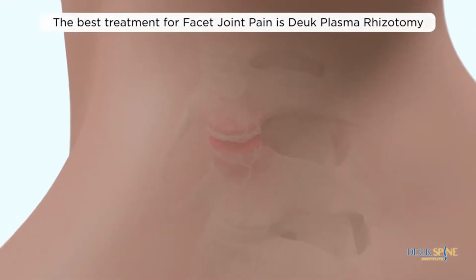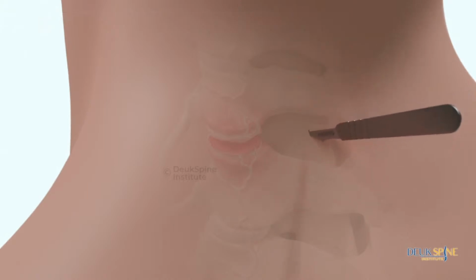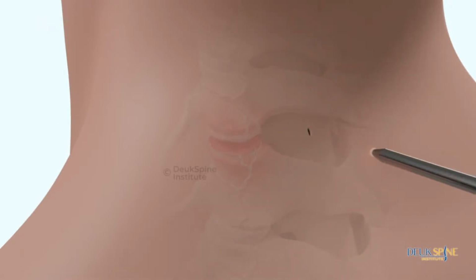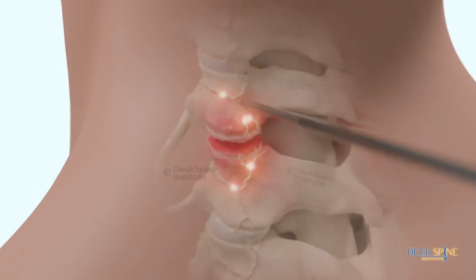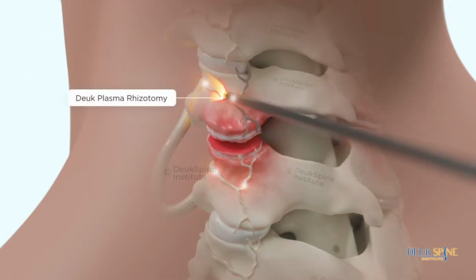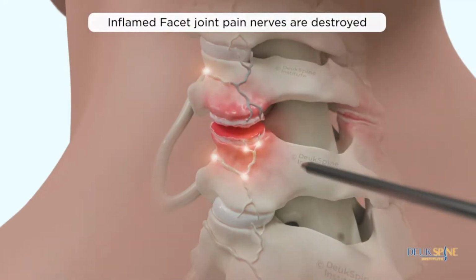The best treatment for facet joint pain is the Deuk plasma rhizotomy. The inflamed facet joint pain nerves are destroyed.